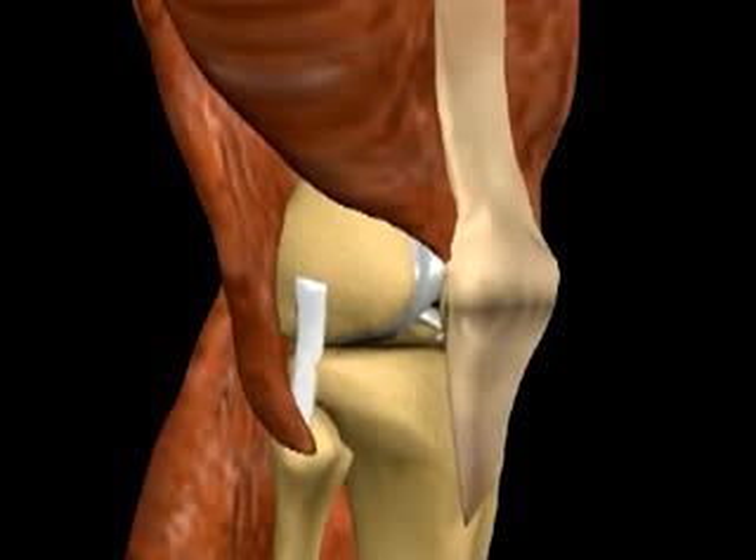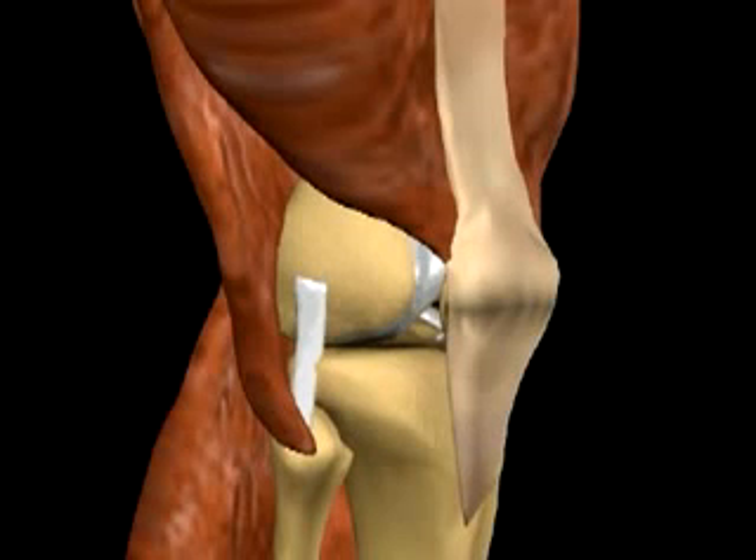With the patient in a supine position, a 4 to 6 cm incision is made over the distal lateral aspect of the thigh. The iliotibial band is split longitudinally and further blunt dissection is carried out to expose the lateral metaphyseal and diaphyseal flare of the lateral femur.